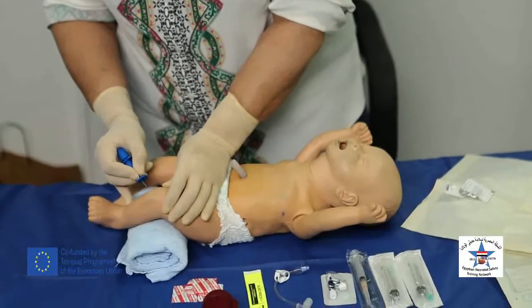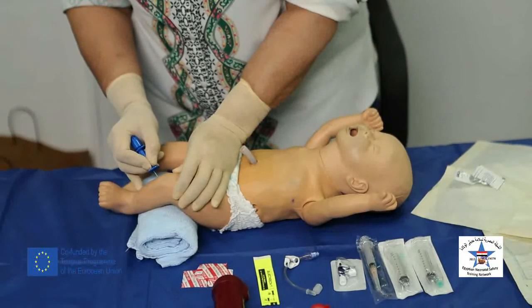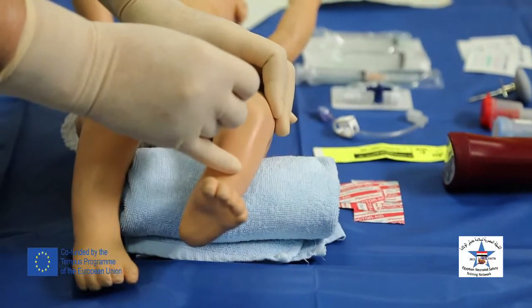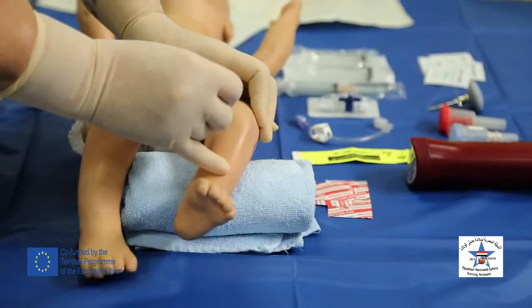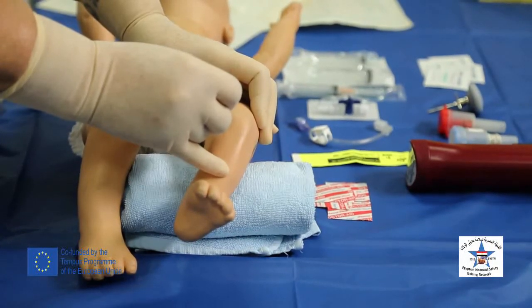Approach the site of insertion in a perpendicular manner and pierce the skin and subcutaneous tissue. After piercing the skin and the subcutaneous tissue, by applying pressure to the site of insertion, we will reach a point of resistance.